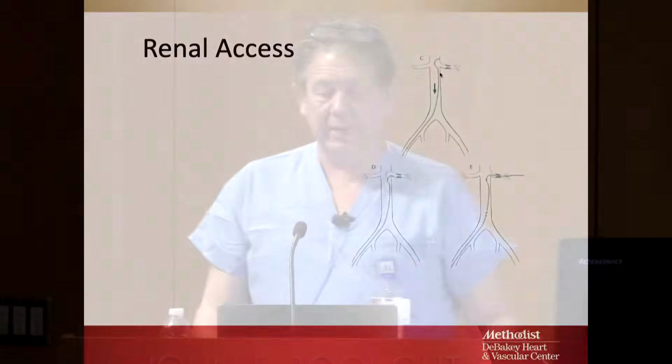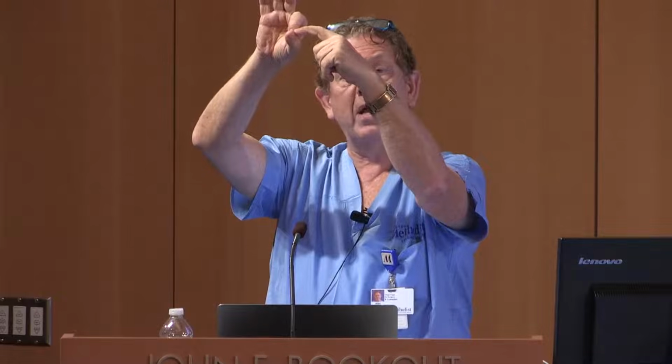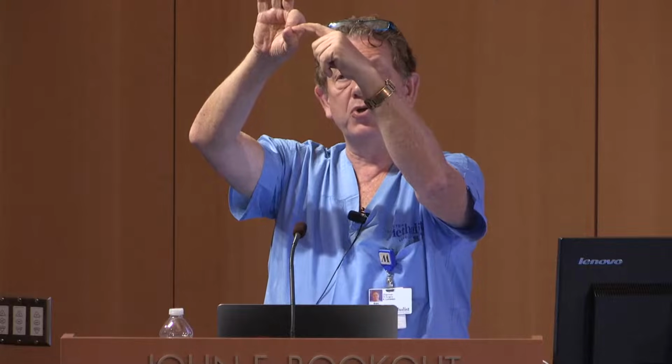So as a general rule, start high, pull low. You can almost always pull a catheter down, but when you try to advance a catheter, sometimes it hangs up in the wall and forms a big loop. So start high, pull down, and get into the target. And what you look for, and again, you'll see this in this model, if that's the renal artery, the catheter is above, and if it pulls down and it doesn't pop, then it means you're off on the curve. You're probably either behind the origin or in front of the origin. You rotate it, and you'll see this pop. That's what you're looking for, is to see the pop when it engages the orifice. And that's a pretty good sign that you're in it.